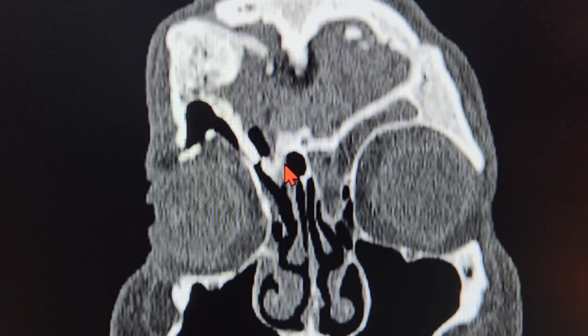where my mouse is. But as you can see, this is the fractured segment, the initial fractured segment which the patient acquired from that road traffic accident, which the neurosurgeons tried to access through this transcranial craniotomy. And they tried to approach this area. They must have plugged a lot of fat over here in this area, but somehow it did not hold much longer. So I'm assuming that's the first site of the CSF leak, the skull base defect, which is exactly in the inferior lateral part of the frontal recess.